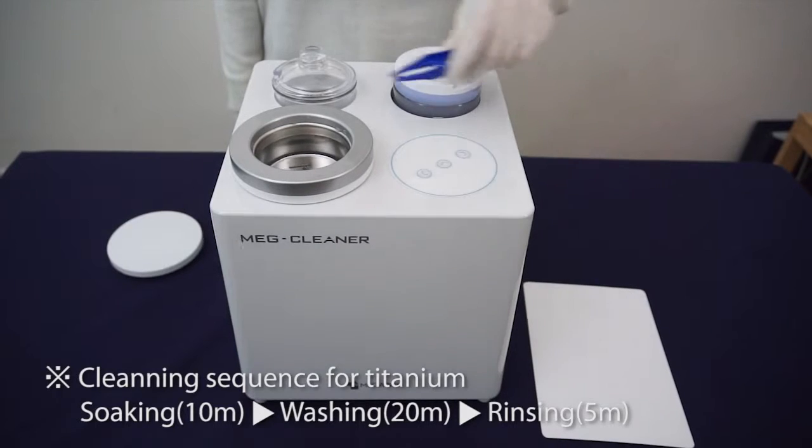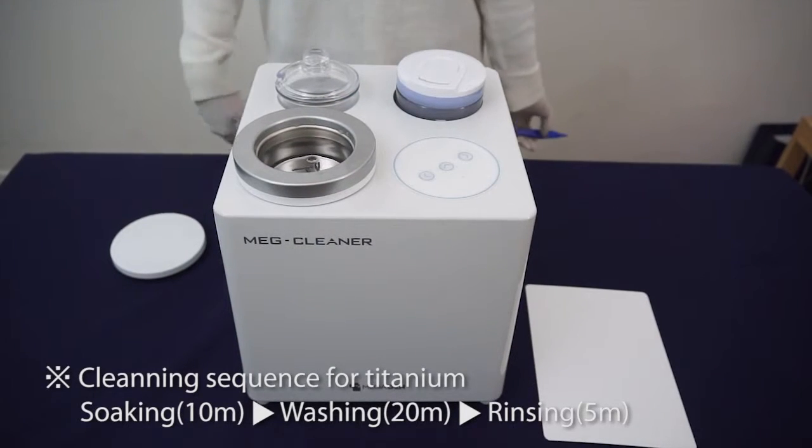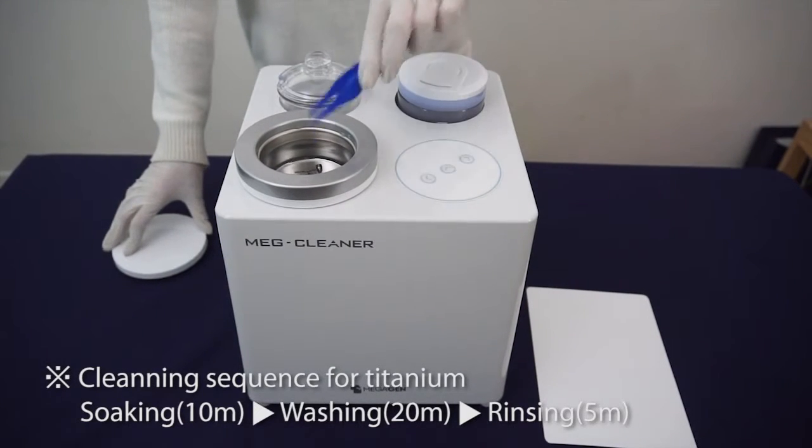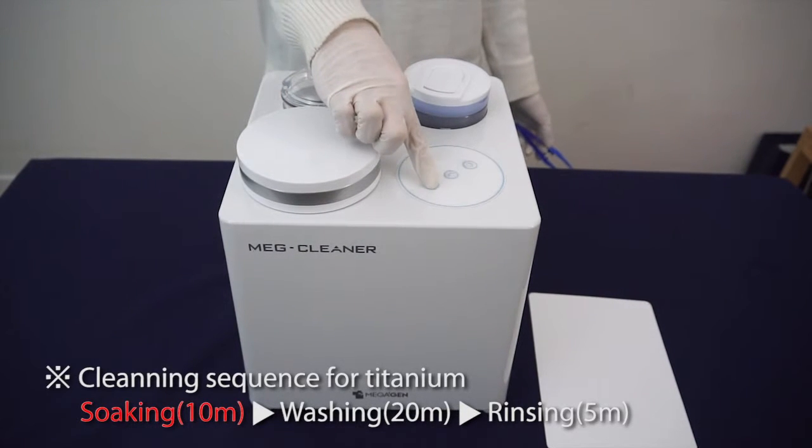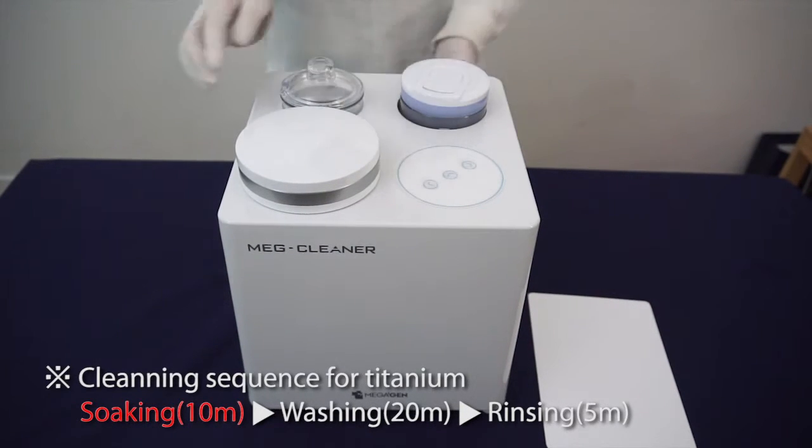The titanium materials cleaning process is: soaking, washing, rinsing. Put the object in for cleaning, turn the soaking switch on, and wait for auto power off after 10 minutes.